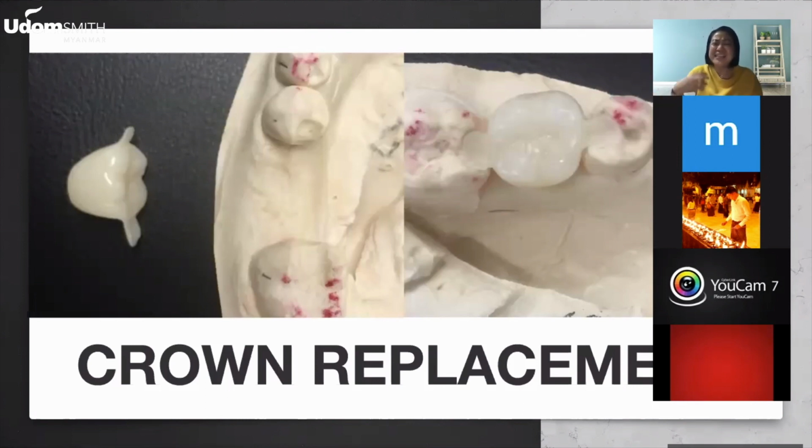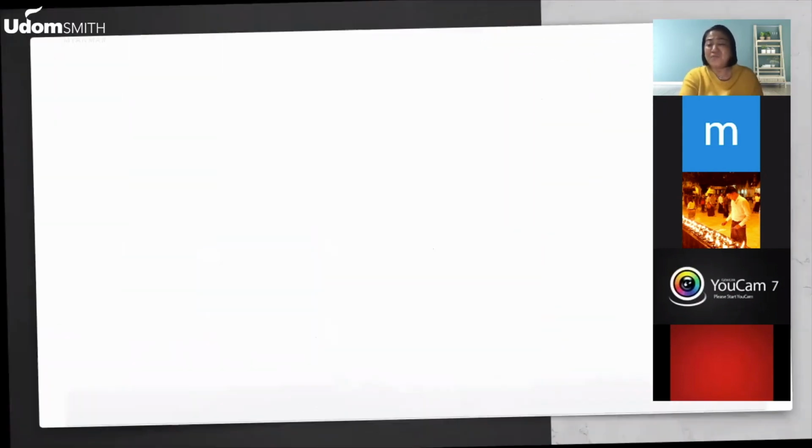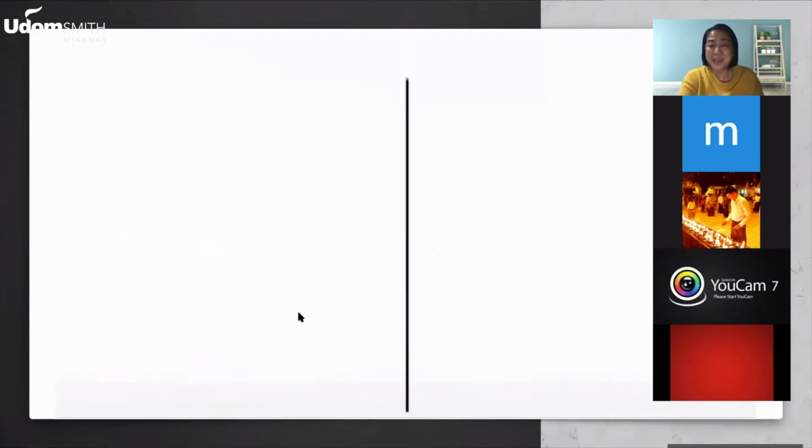A lot of dentists love to do complicated cases with Edelweiss when they have not done it ever. So, in the end, the mistakes become higher. Why? Because they're not used to it. And as I mentioned before, oftentimes because the brain is so used to handling porcelain and composite, the tendency is we handle Edelweiss the same way. And these are two different materials, which can result in a lot of error in terms of placing it and putting it in the patient's mouth.